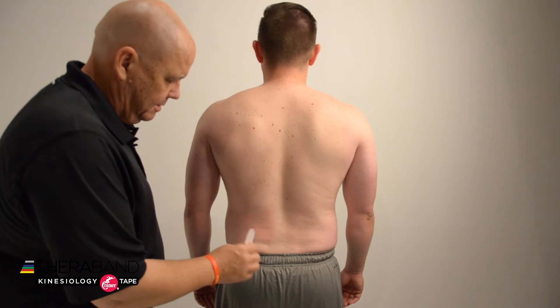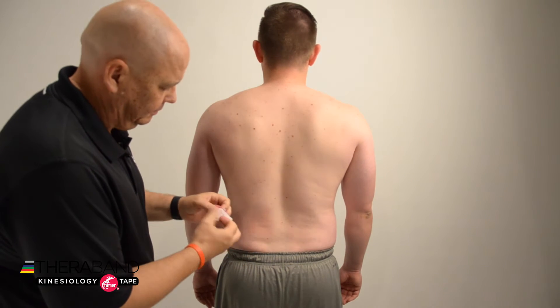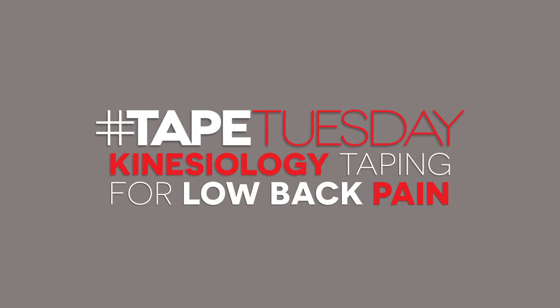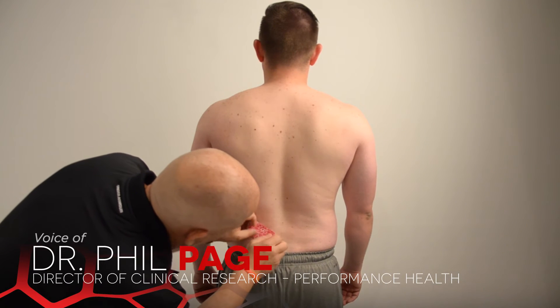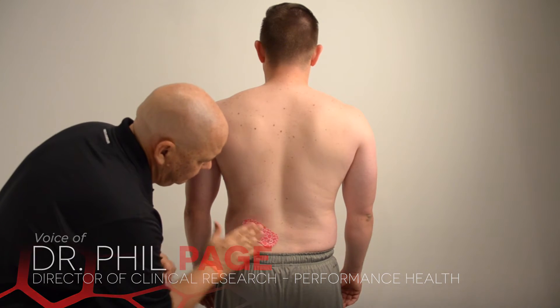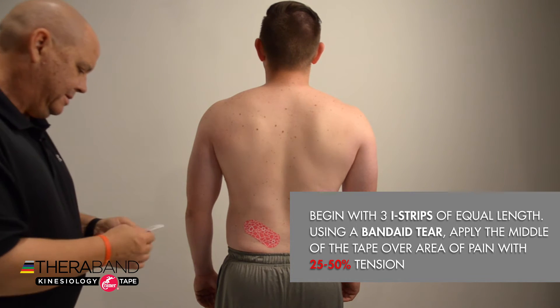For our Low Back Pain STAR application, we're going to begin with about three eye strips that have been cut about four to six inches long. For each of those, we'll break the middle of the backing with a band-aid type tear. We'll apply the middle of the tape right over the side of the pain with about 25% to 50% tension, and then lay down the anchors on each side with no tension and rub the tape to activate the adhesive.